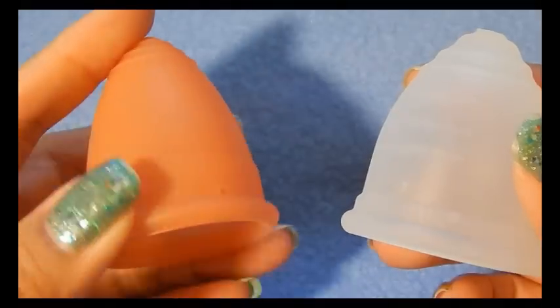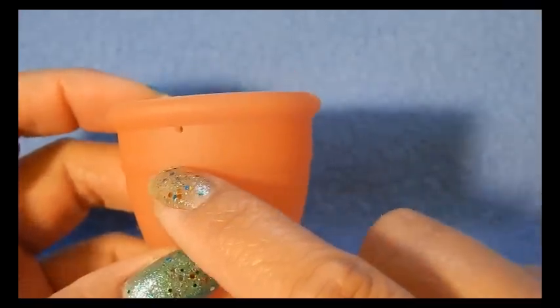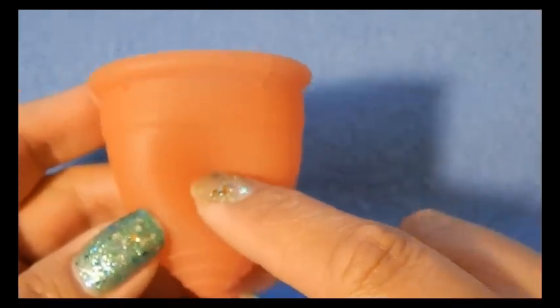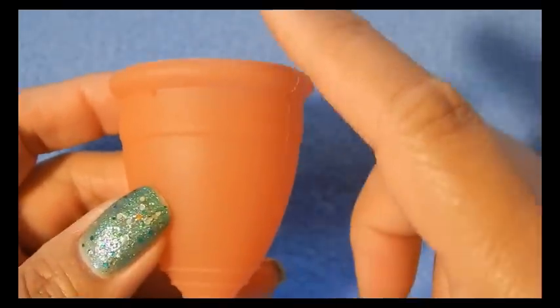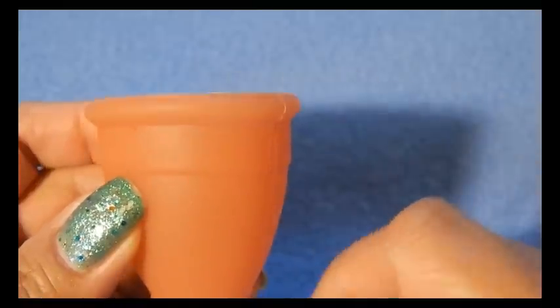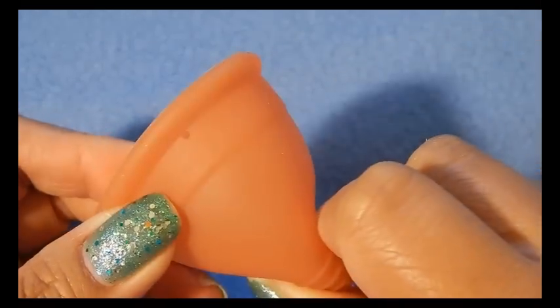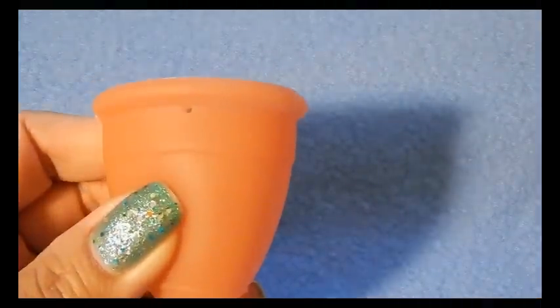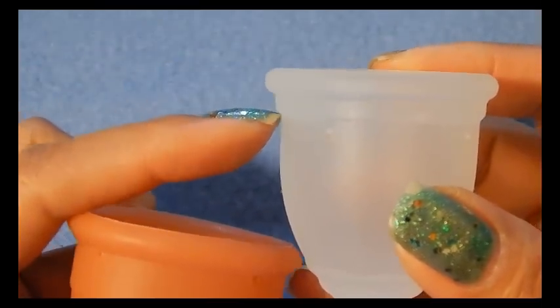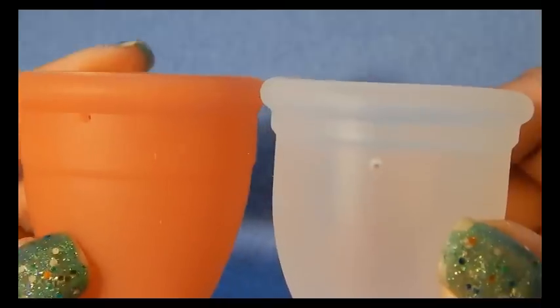I talk about secondary rims quite a bit in my other videos. When I refer to the secondary rim, I'm talking about this line here — it's a transition between the bottom of the cup, the softer part, to the top rim, which is the most firm part. The cup gets a little more firm at the secondary rim and then the firmest part is at the top. That just aids in opening the cup because it has more resistance. The Ruby cup secondary rim is just below that top rim, so it's really high up there, whereas the Lunette secondary rim is noticeably lower.